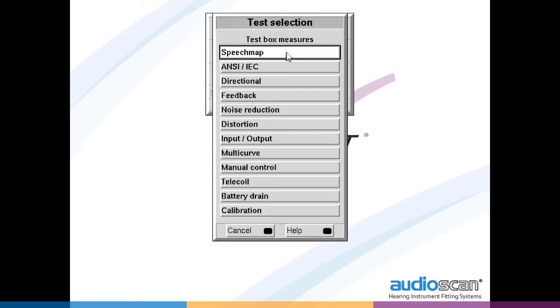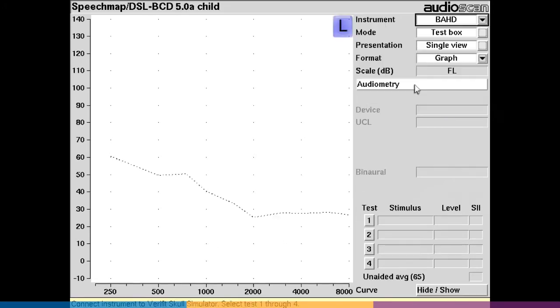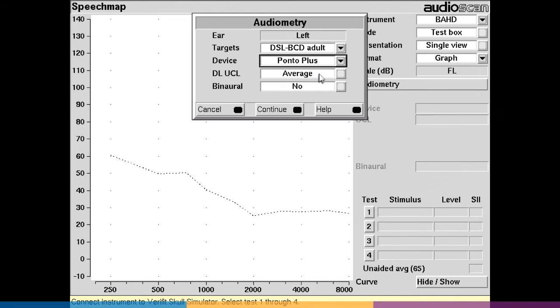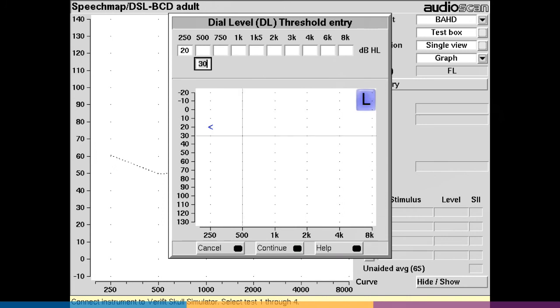Select speech map from the menu. From the instrument drop-down list, select BAHD, then select continue. Select audiometry on the speech map screen. Select the desired fitting rule: DSL-BCD adult, DSL-BCD child, or none. Select the device to be verified from the drop-down device list. If you will be entering dial level UCLs, change the setting from average to enter. Select yes or no for binaural summation correction — note this is only available for the adult formula. Select continue, then enter the dial level thresholds by clicking on the graph. Note dial level values are obtained from abutment-based BAHD generated audiometry in the manufacturer's fitting software. Select continue.